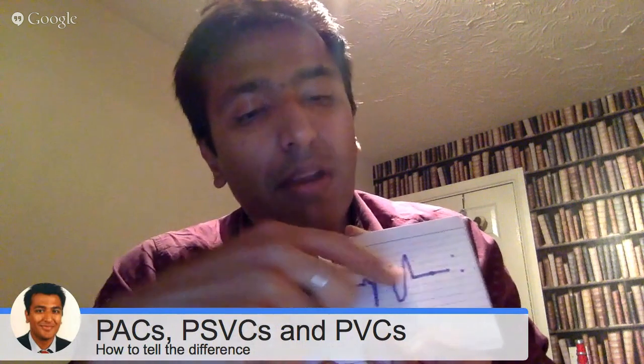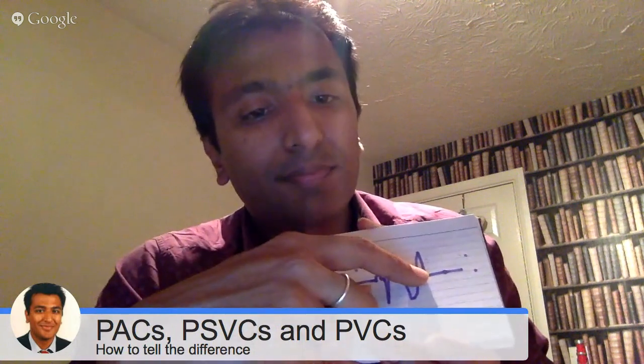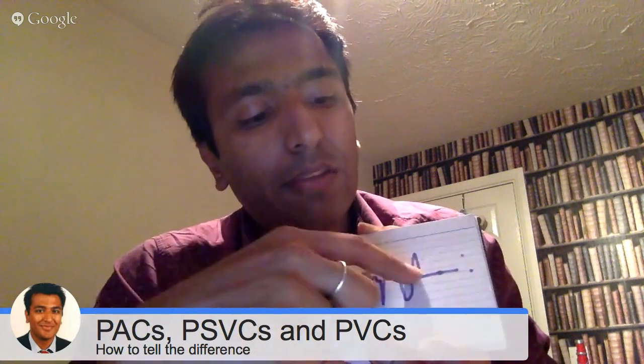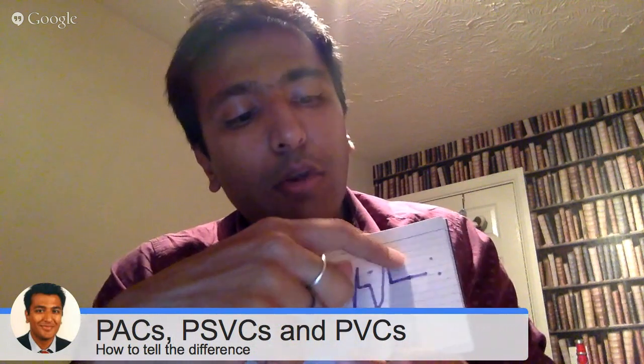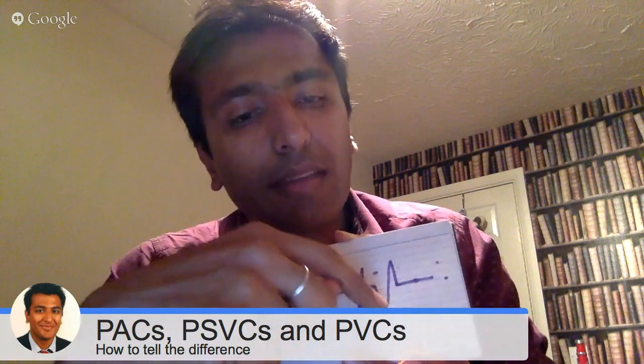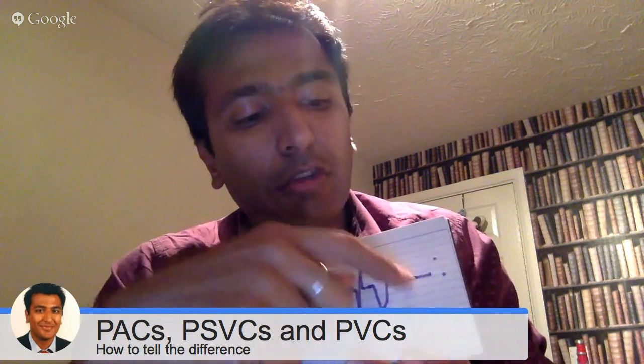And you know that this impulse is going to be very ineffective at causing a heartbeat, okay? And that's why it's important. Now, if you get 2 or 3 in a row and they look identical, you would call that unifocal ventricular ectopics, i.e. they come from the same place in the ventricle. The impulse is being generated from the same place.